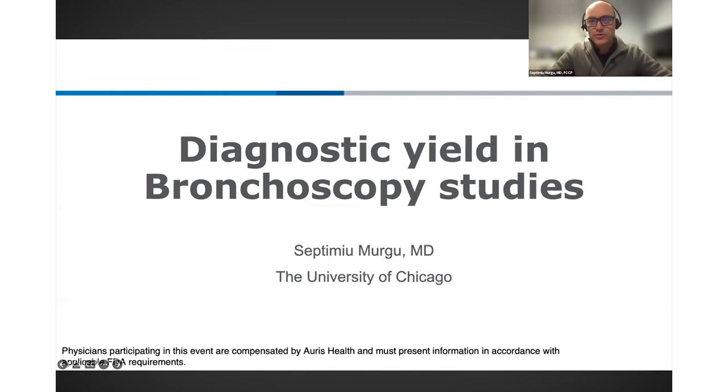So I will start with this because as I review the literature on bronchoscopy studies, which will be addressed in more detail by Dr. Joseph Cisenia, we are puzzled to see how many diagnostic yields are reported out there in different papers. Some of them may be related to the technology, some may be related to the experience and expertise of the bronchoscopist or the instruments being used once a target is reached. But a lot of it has to do with the way we define diagnostic yield.